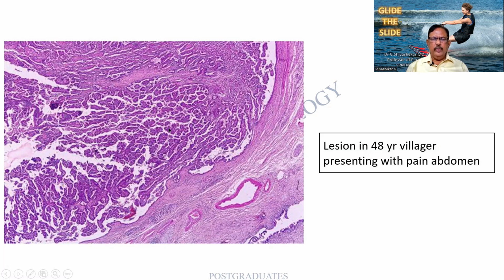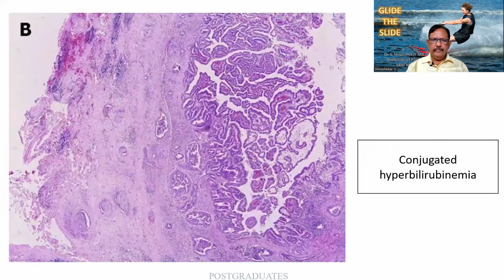magnification, I would like to appreciate the branching and the rebranching appearance of this, which is better brought out over here. And if you people are not very clear about it, go to the history of conjugated hyperbilirubinemia. Please be very careful with these words, conjugated hyperbilirubinemia.